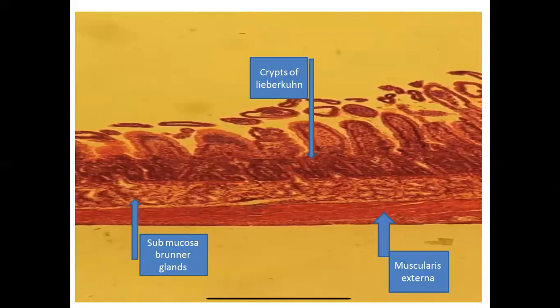Okay. مثل ما قلنا مسبقا the lining epithelium of the small and large intestine is simple columnar epithelium.